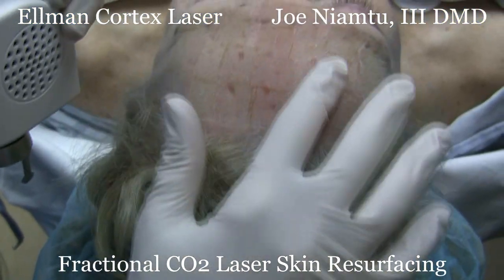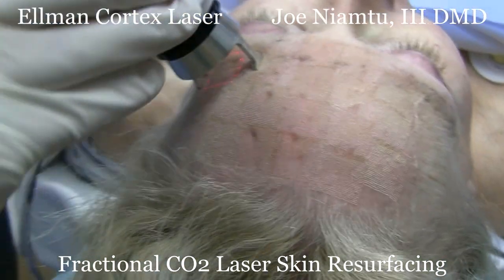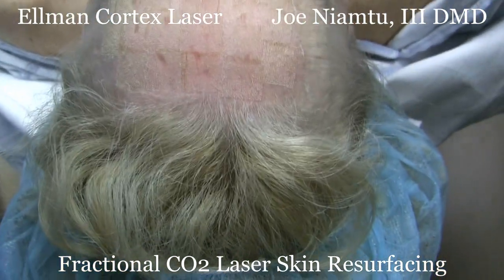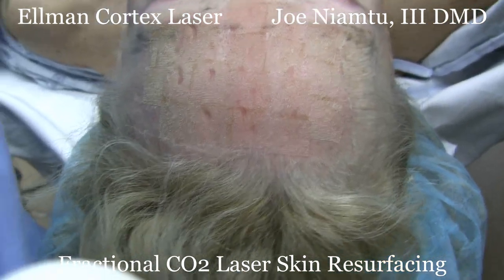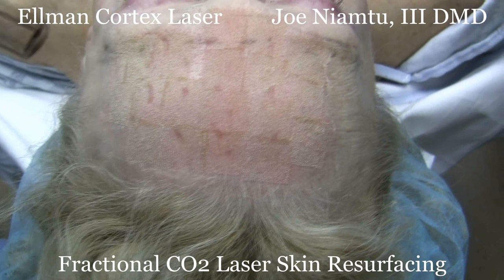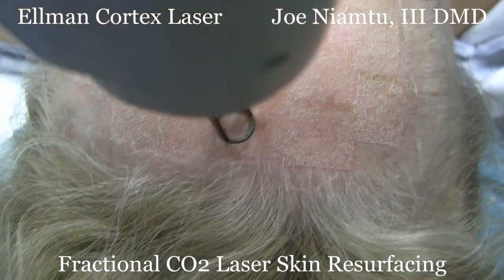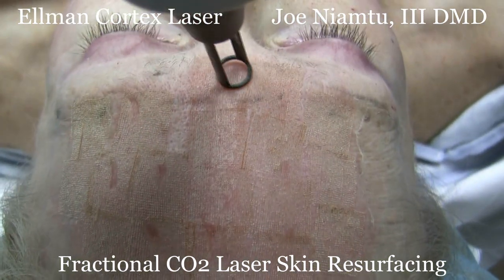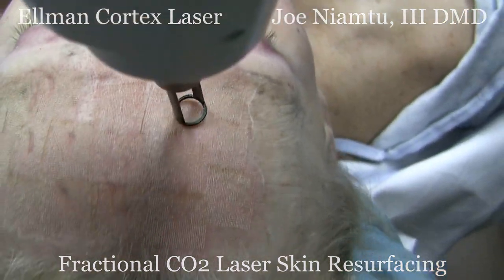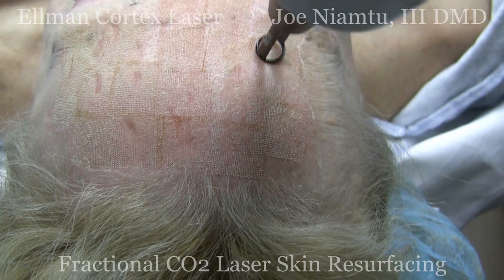The whole purpose of fractional resurfacing — if you look really close you can see that there's treated area and untreated area. You also always have to be careful of people's eyebrows and eyelashes. People will use the erbium laser to burn off the skin char, and I'm really not a big fan of burning off the skin char — I think it serves as a biological dressing, but we'll show you how that's done. It also helps homogenize any areas you may have missed, as the erbium is a pretty light laser. I like it more for brown spots and lesions, but I'm just showing you the various applications.